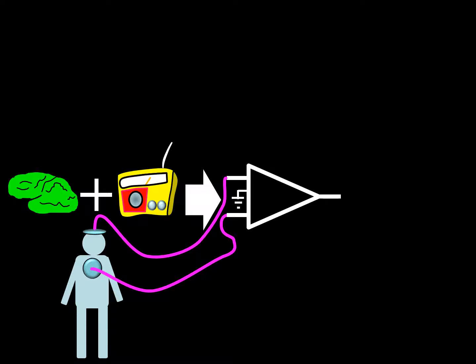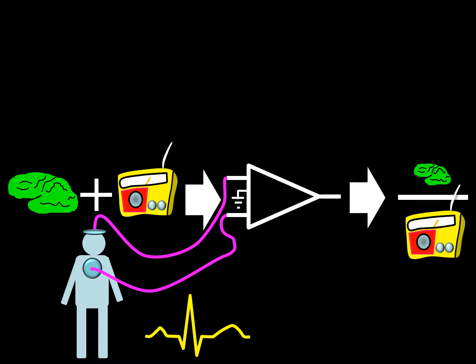Next, in the search for the perfect montage, the early investigator went on to connect input 2 of the differential amplifier to the anterior chest wall. But cardiac artifact was very prominent in the EEG epochs collected this way, to the point of often overwhelming the cerebral activity in many epochs, thus making all these epochs so collected unreadable.